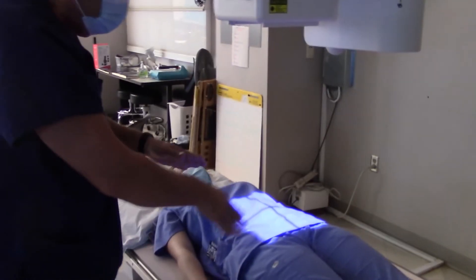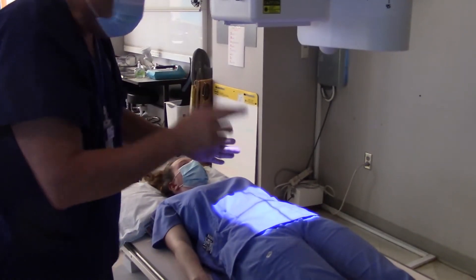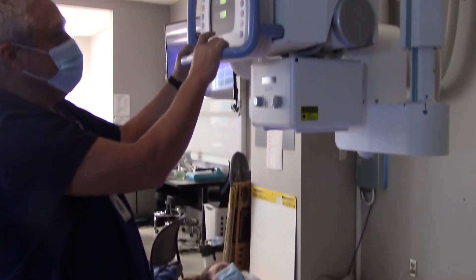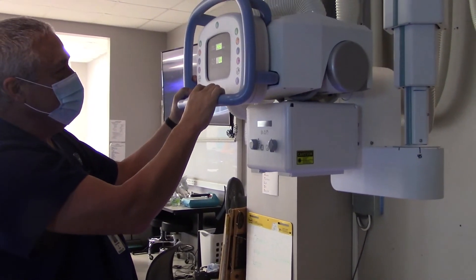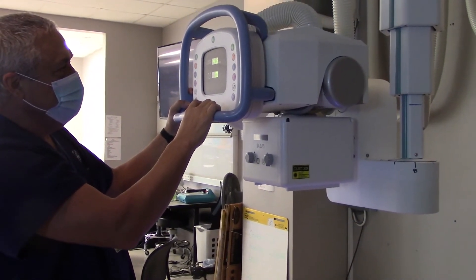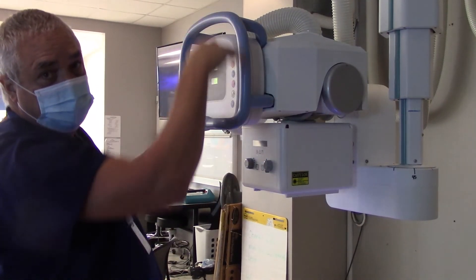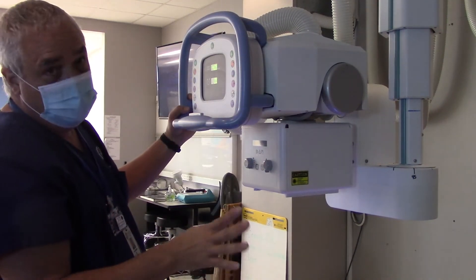With this setup, I'm going to hopefully include the diaphragms and the symphysis. I'm at a 45-inch SID — I'm supposed to be at a 40-inch SID so let's bring this down. If your facility allows you to use a 50-inch SID, that's totally permissible.